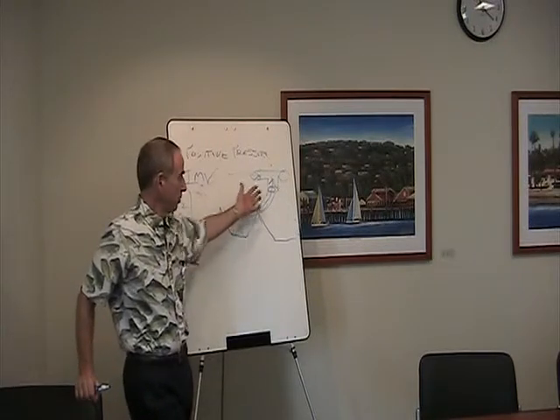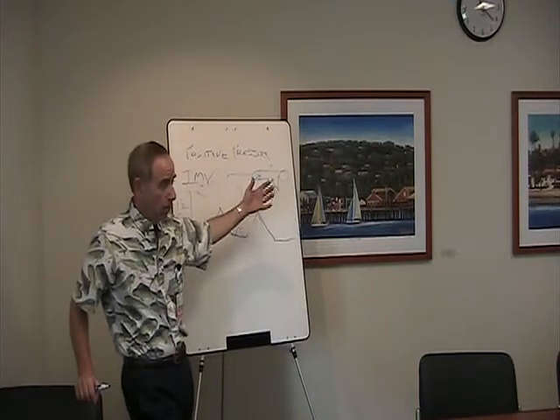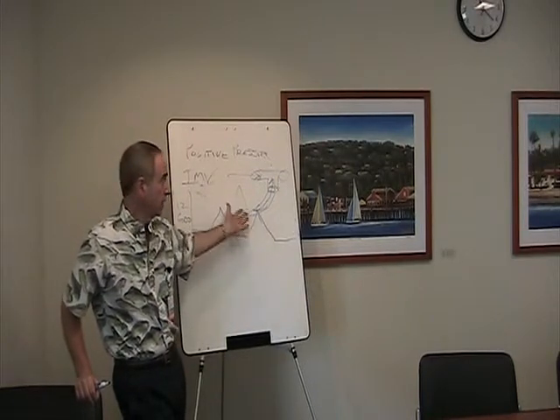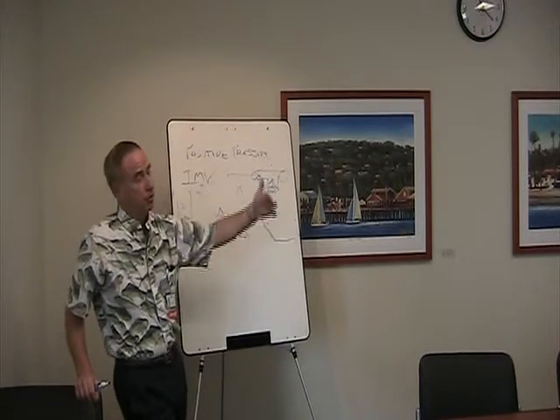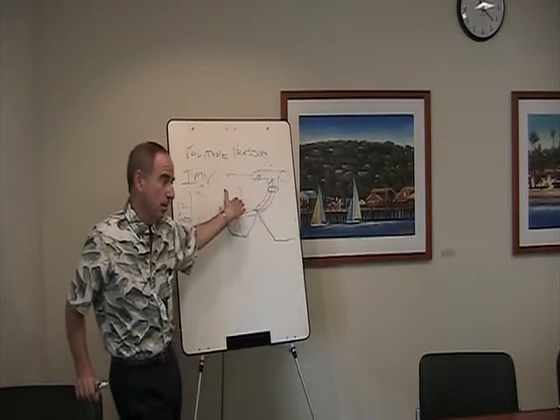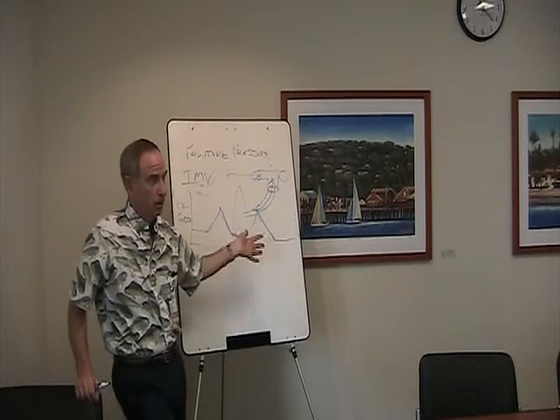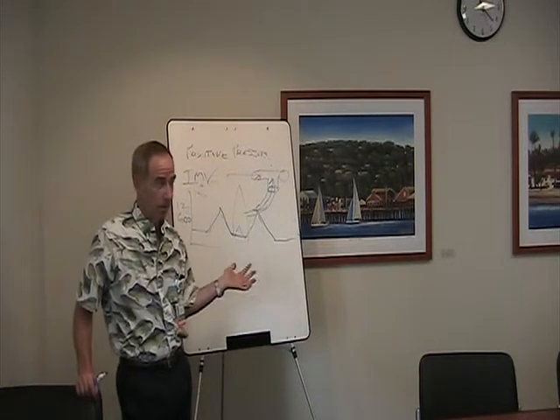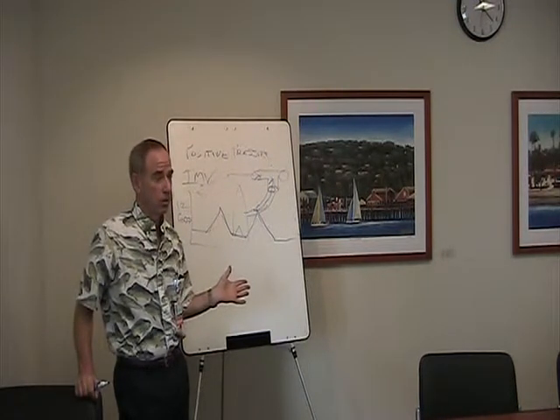So the way you wean somebody is you put them on a T-piece. You would allow them to go for as long as they could, until they developed some sign of distress, and then you'd put them back on the ventilator. That could take 5 minutes, it could take 2 minutes, it could take 30 minutes. And then you would gradually try and increase the amount of time that they would spend on the T-piece off of the ventilator. And once they got up to about 2 hours on the T-piece, they were felt to be able to be breathing okay on their own. You would extubate. Okay, so that's how weaning was done from assist control.